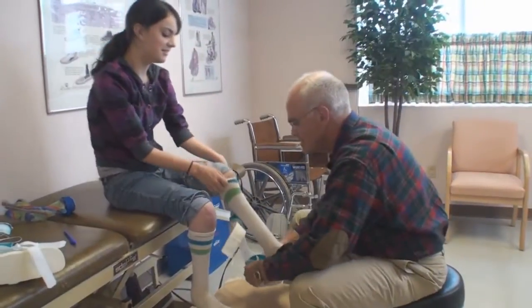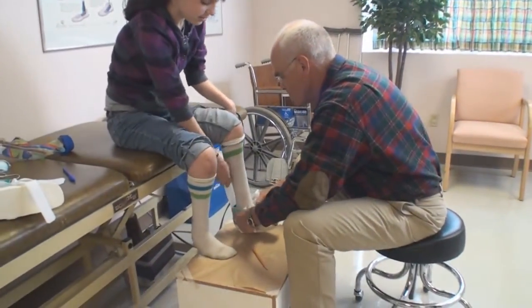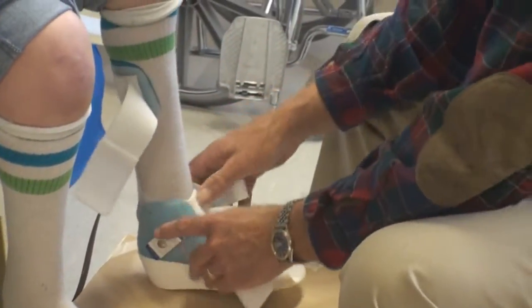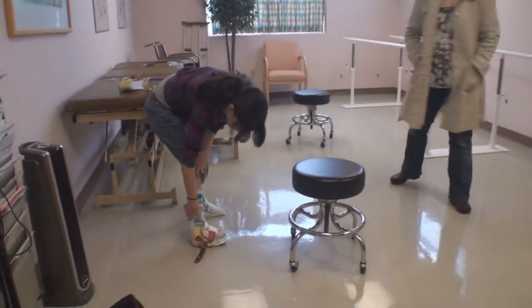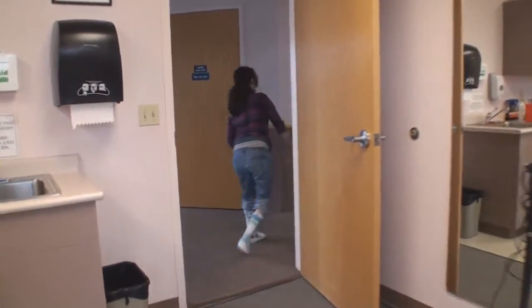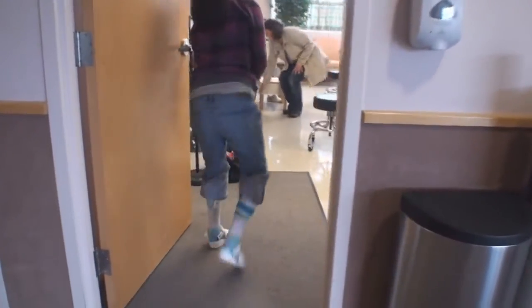When the patient comes back in, we try it on and get to see how it actually fits. There's a lot of things that can be slightly off. We not only want to see if it's comfortable, but we want to see if it moves well with the patient — looking for both comfort and function. Does the brace move like we expected? Does it put the patient in a place where they feel comfortable? Do they get their function restored like they anticipated, or is it off some way?